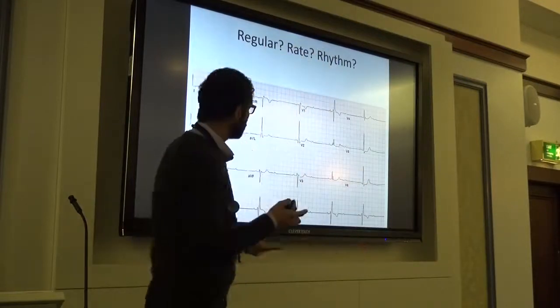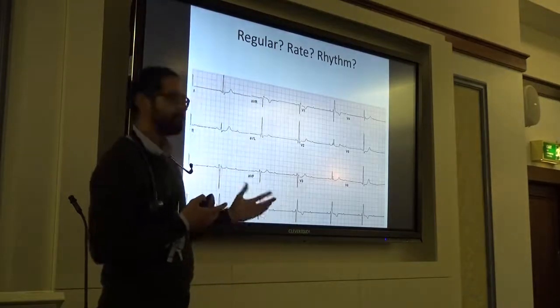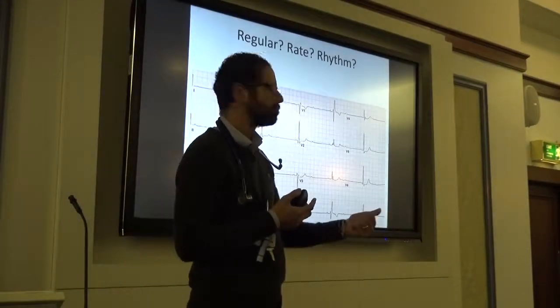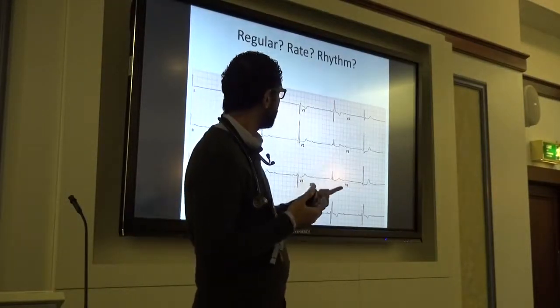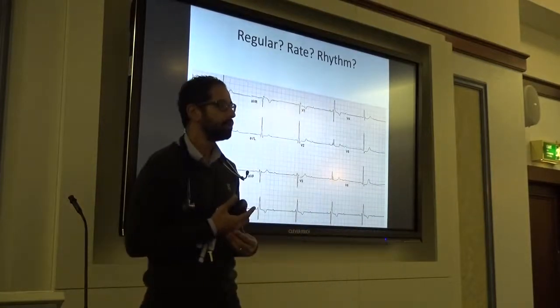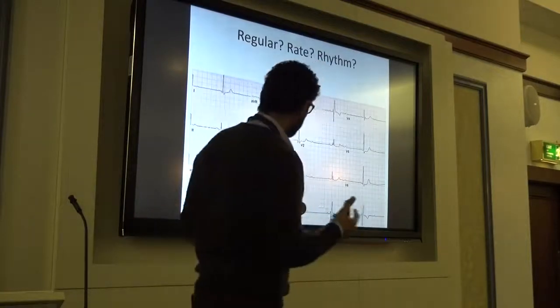So what do you think is happening here? What's the rhythm, first of all? So we said it's regular. We said the rate. We said what's the rhythm? If it's regular, usually it's going to be sinus, yeah. Sinus, very good.